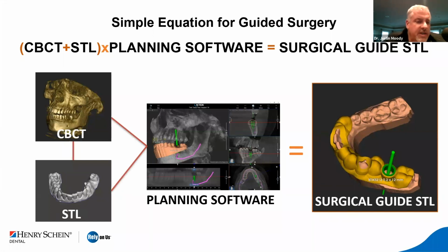And you're also going to need the surface scan of the patient, whether that comes from an impression or an intraoral scanner, but we need to create that into what's called an STL file. And sometimes I've heard people talk about STL files as straight to lab, if you want to remember that.